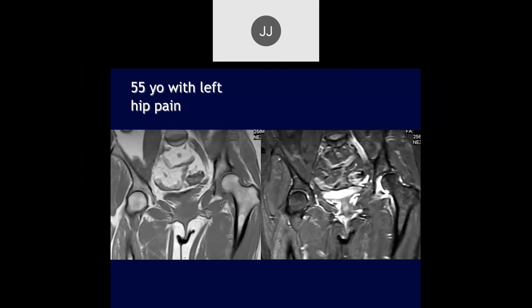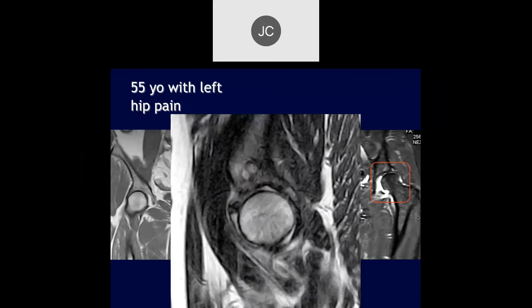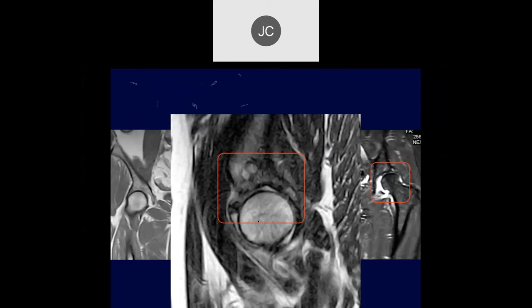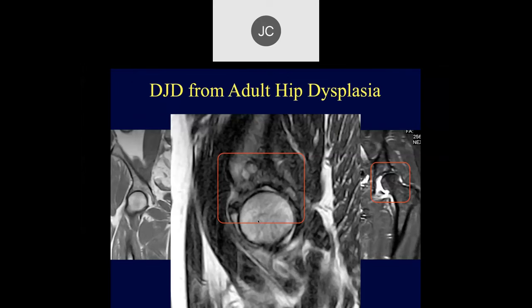We have a 55-year-old with left hip pain. It looks like that left hip is almost dislocated. There's a large joint effusion, some acetabular undercoverage — so I think it's dysplastic. You see a lot of bony changes of the acetabulum.